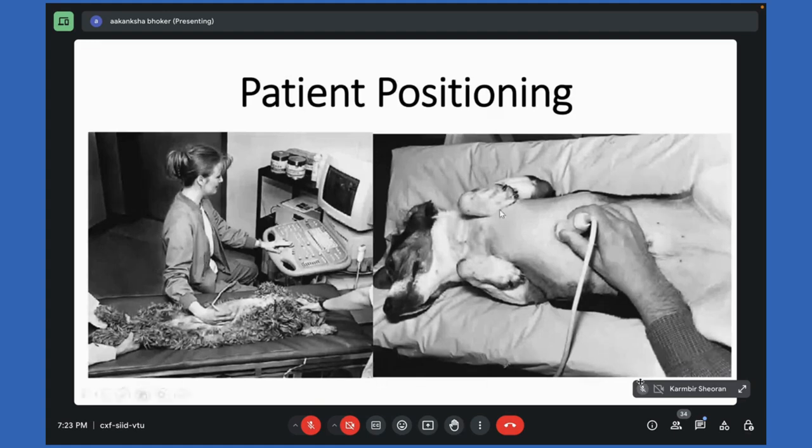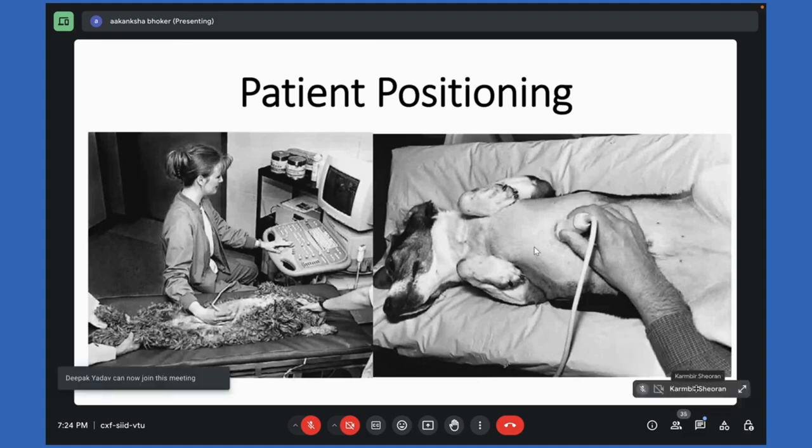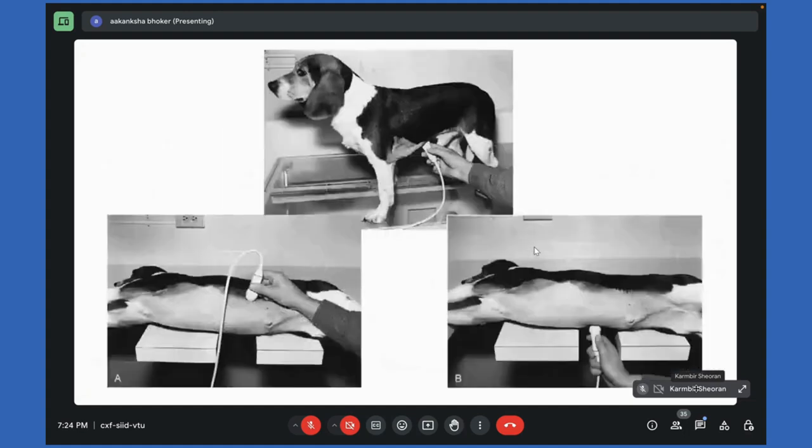Now this is a V trough, which you can see. It lets the patient lie in dorsal recumbency very comfortably. You can see no one is assisting, no one is holding the hands or limbs of the dog. If the dog is cooperative, definitely; if it is somewhat less cooperative, then the owners or some assistant can hold the limbs for you. But positioning in a V trough makes the dorsal recumbency very comfortable for the animal, and dorsal recumbency is generally preferred for performing the sonographic examination. Although the examination can also be done in lateral recumbency or maybe in a standing animal also.